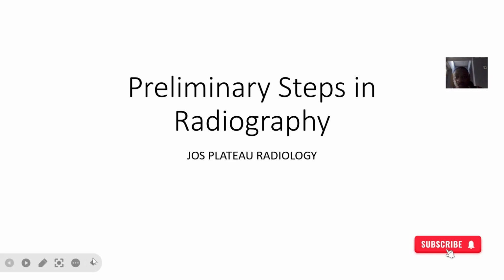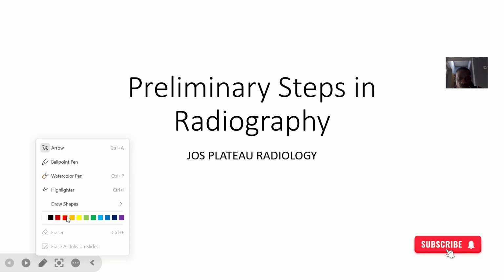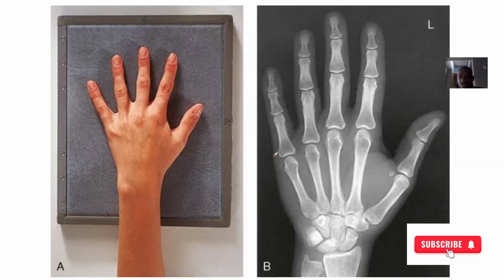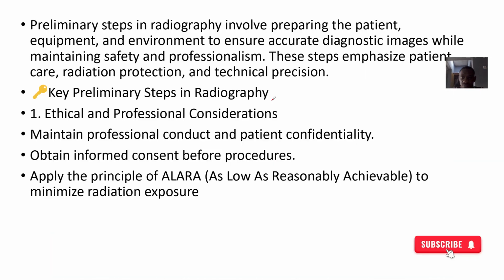Now we're looking at preliminary steps in radiography. Preliminary steps are more like things that you do to ensure that the radiograph is actually what went on, so nothing was missing, no step was missing. So for radiography, the steps you actually take include the following.